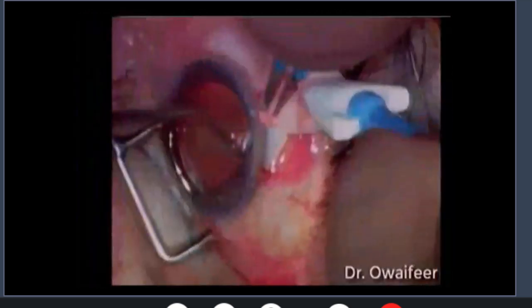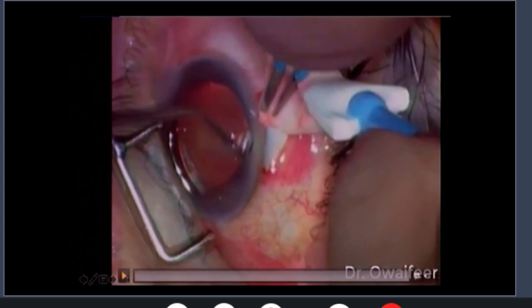Before moving on to talking about glaucoma drainage devices, I'd like to just demonstrate the surgical technique that I use in doing phaco with trabeculectomy. This is one of my oldest surgical videos. I was a resident at the university hospital with Professor Aysam Athman. That's why the quality is a bit low.